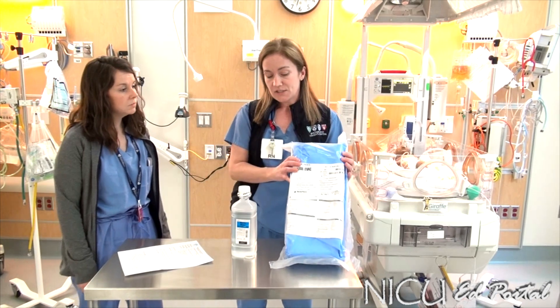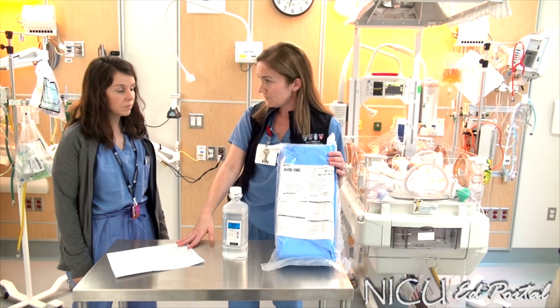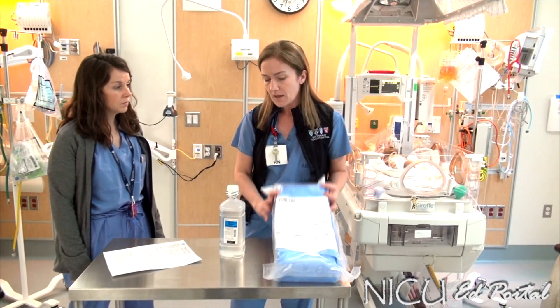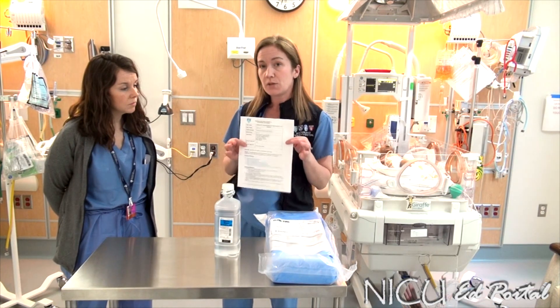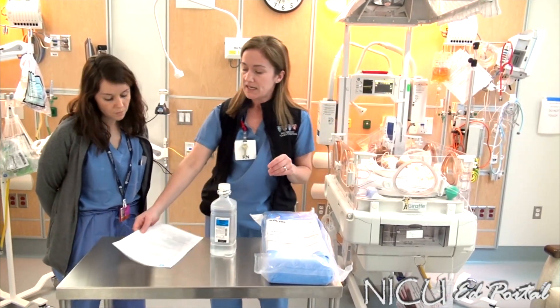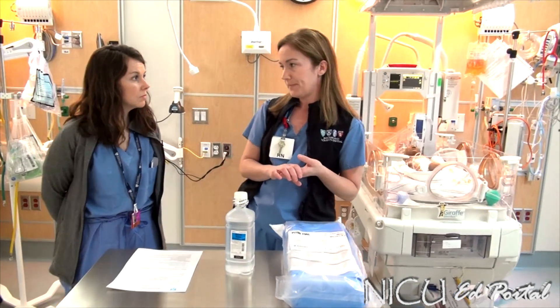For purposes of this in-service, we're going to go through the equipment that you need to gather, the policy that is available for you to refer to, and then we will walk through setting the system up. Any time you have an infant that's going to need either a thoracentesis or a chest tube set up, you would refer to our nursing policy, NICU C8, which has the policy and procedures and the steps on how to set this system up.